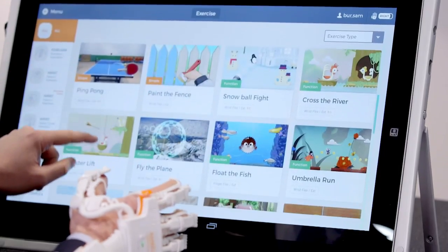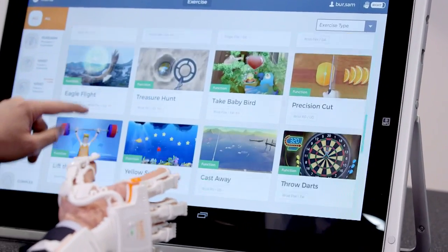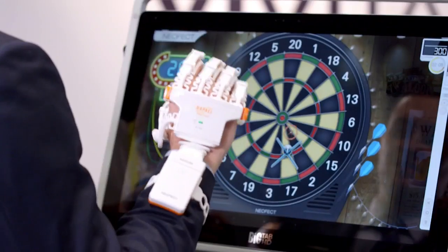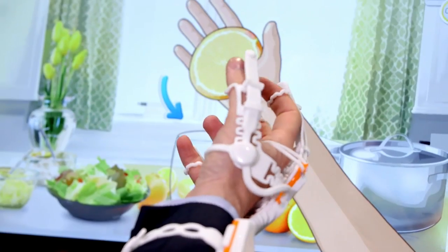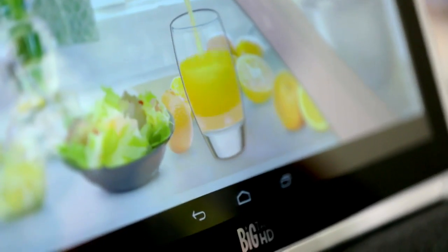This is basically rehab through games — these are the games for physical therapy. You can virtually do a lot of activities which may be challenging in your real life if you are a stroke patient or any type of patient with a brain injury.